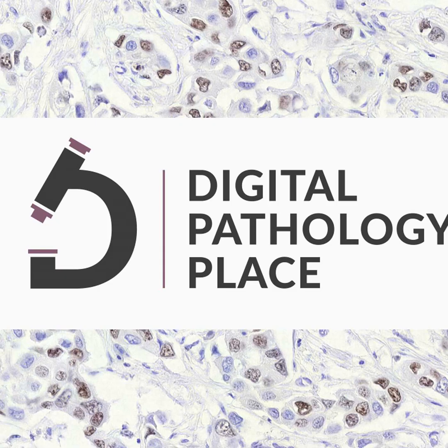In pathology, AI has found significant application, especially in the area of image analysis. AI automated image analysis algorithms can assist pathologists with detecting and classifying abnormalities in tissue samples. These AI algorithms can handle a massive volume of images, performing tasks like segmenting specific structures, quantifying biomarkers, or even predicting disease progression based on patterns in the tissue.